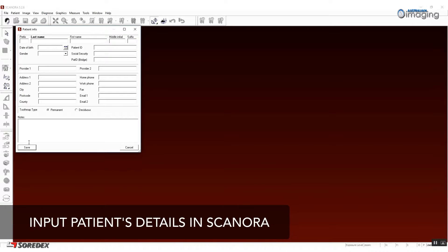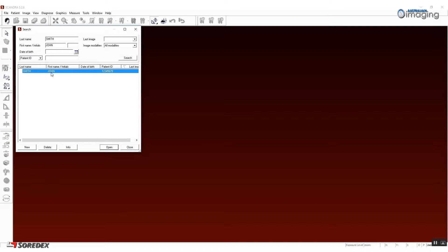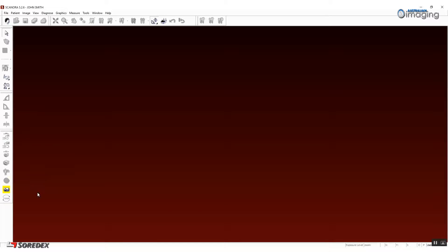The first step is to prepare the patient in Scenora. Open your Scenora software and input your patient's details. Then select the patient from the work list and click CB3D Capture.